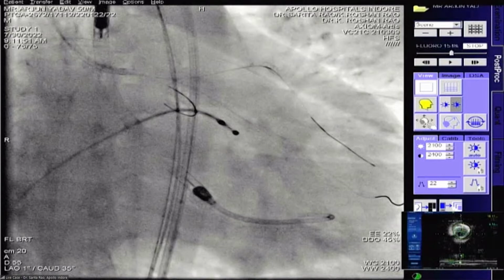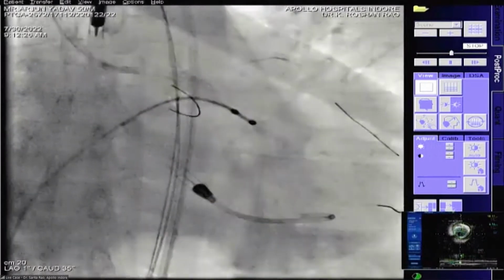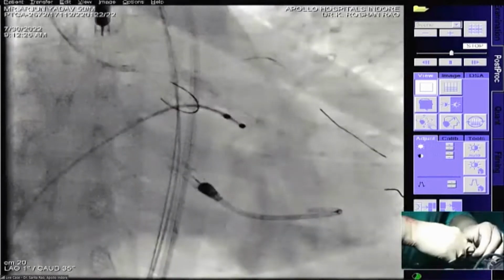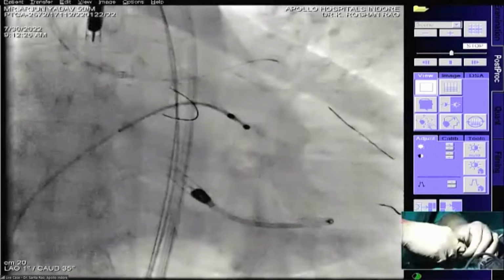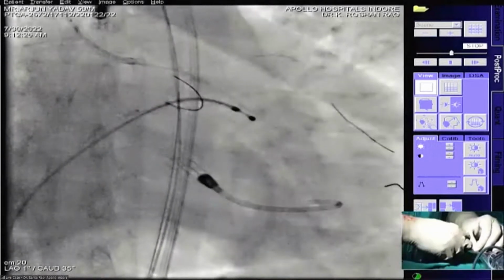Sorry, we did lose you for a little bit. What happened when you inflated the balloon? You said the patient became bradycardic? The pressures, we had a flat line on the pressures, and the rate started decreasing. I have a temporary pacemaker in for backup too. At that time, essentially the entire impeller was inside the ventricle, so it was not giving good hemodynamic support as we want it to be. So pulling it back definitely will improve. Yeah, I think that helped. The second thing is we took a bolus at that time. The pressures came back pretty fast.